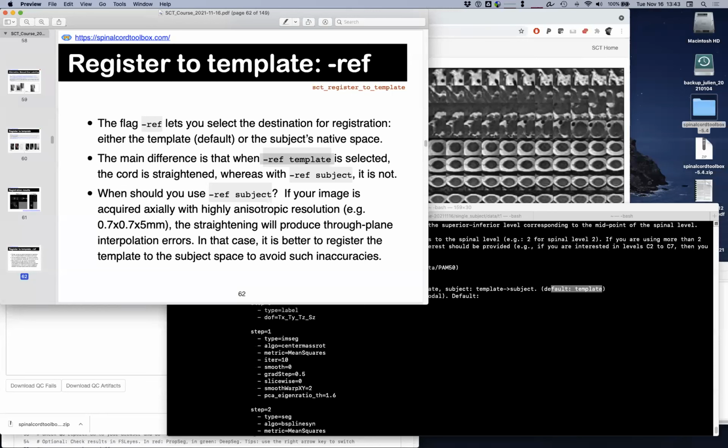So I really invite you to try both, and it helps understanding the subtleties behind those flags and the ways we can register the data. But the main rationale and the motivation for choosing one parameter versus the other is really explained here. Ken, do you have another question?